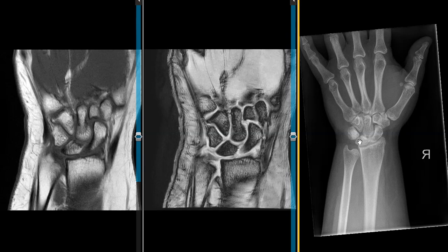On X-ray, rather than looking normal, it will look really white as it gets reactive bone sclerosis. The next stage will go on to collapse and just be smaller in size, and after that the patients will develop bad arthritic changes associated with this. So this is an example of early Kienböck's disease, which is avascular necrosis of the lunate bone. Again, it's related to this negative ulnar variance and abnormal stress here, and it could have been incited by that old injury — if the patient did have a subtle fracture or injury, it was the first domino to go down to cause the signal changes. And that's it, thank you very much.